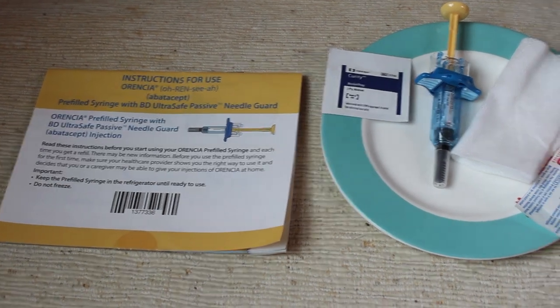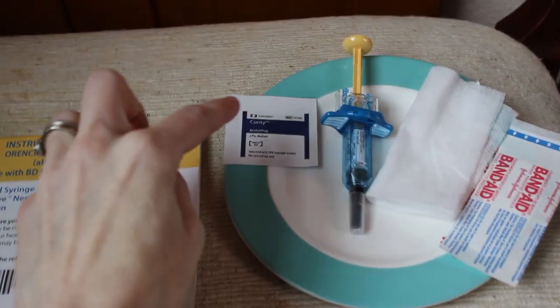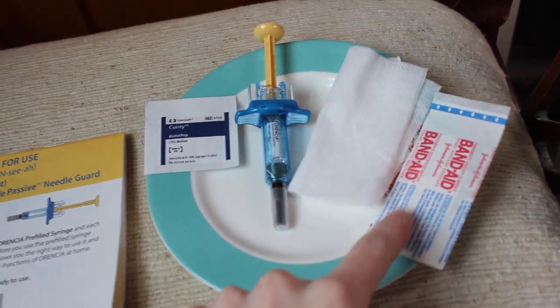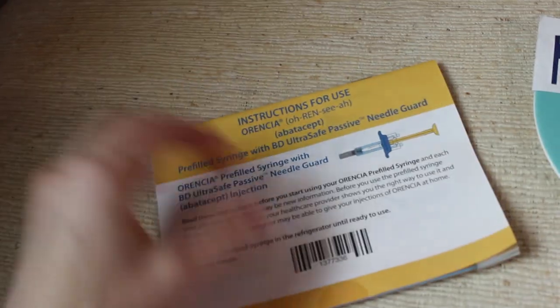Here are the supplies you need. After you wash your hands, you get your alcohol swab, the injection, and either gauze, tissue, or a cotton ball. Then your band-aid. I did want to mention that the little manual that comes with it is super helpful — it has a whole bunch of step-by-step directions, so I'm not going to go through every single pointer. I'm mostly going to show you what it's actually like as a patient.